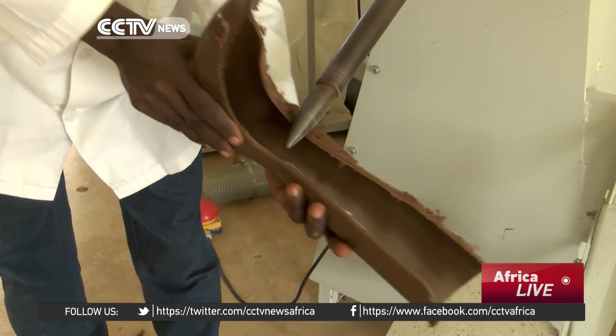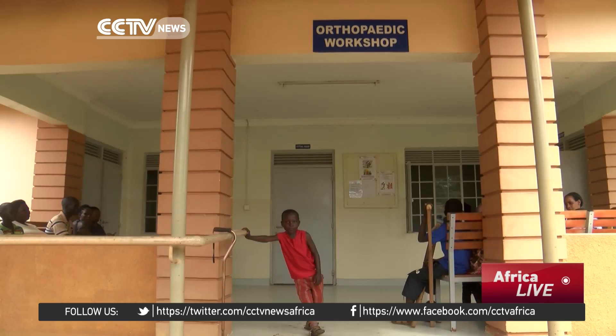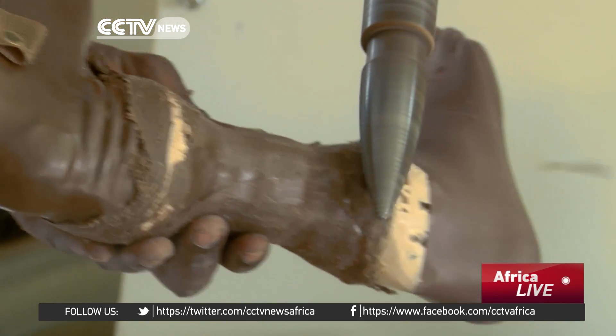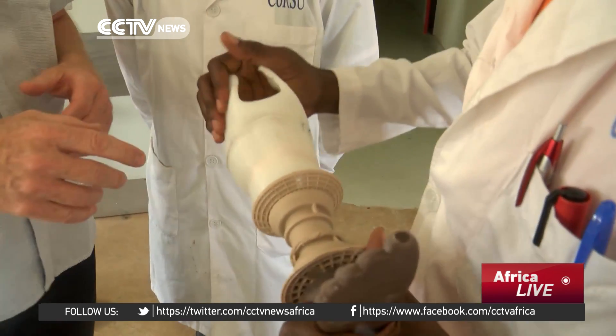Before this concept arrived in Uganda about two years ago, the manual method was being used, which involves molding layers of plastics. The few functioning orthopedic workshops in Uganda still use the manual method, which is time consuming and tiring. 3D printing provides a complete digital design-to-production tool chain, resulting in greater accuracy, faster output, and less waste — unlike plaster casting which creates a disposal problem.